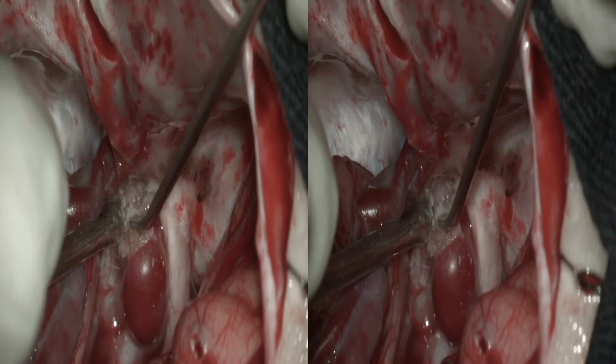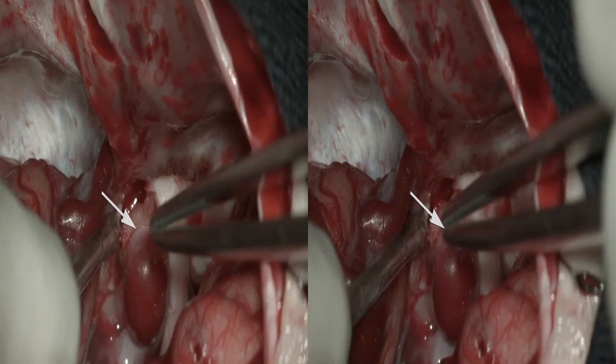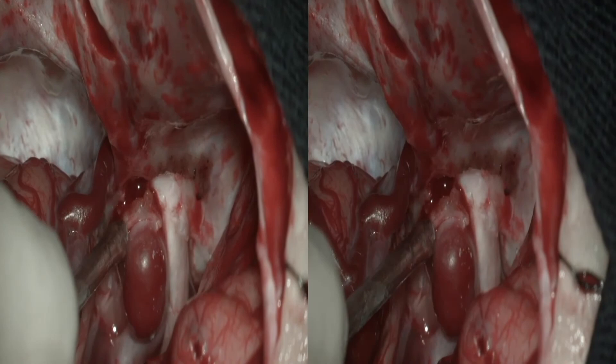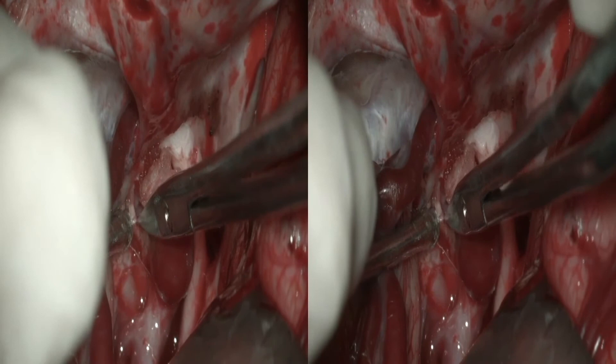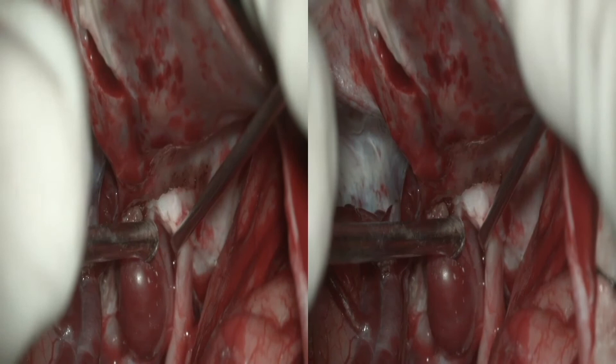The upper ring of the clinoidal segment of the carotid artery is highlighted with a white arrow. A small piece of bone is still on the cavernous sinus. At this point, small venous bleeding is observed. The dura arising from the supramedial aspect of the anterior clinoid process continues medially in an oblique plane that intersects with the internal carotid artery to form the distal dural ring.